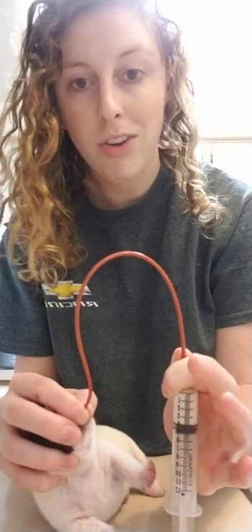I am to the black mark, so I reach around his head and hold it with my thumb and my forefinger. And with my other hand, I just kind of push down on the syringe and feed him.